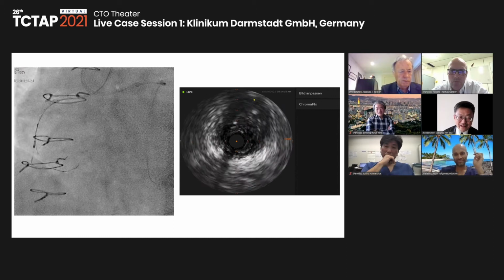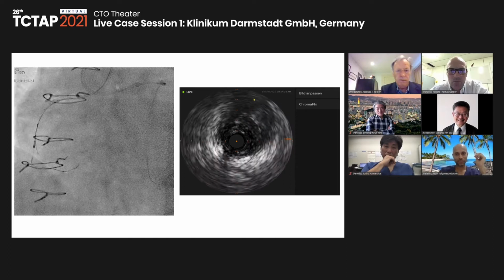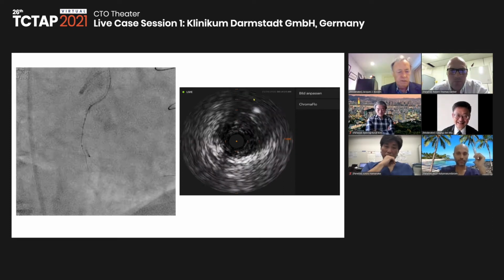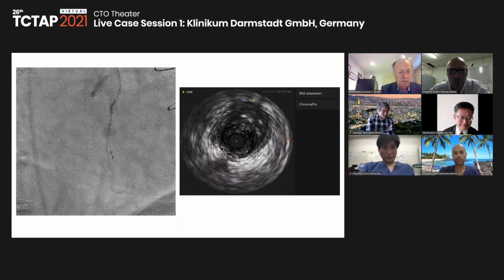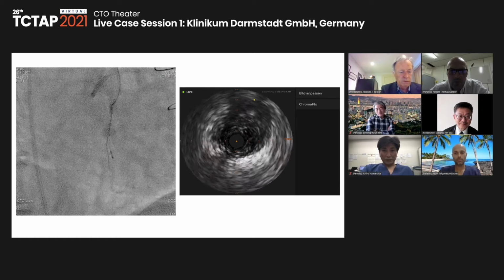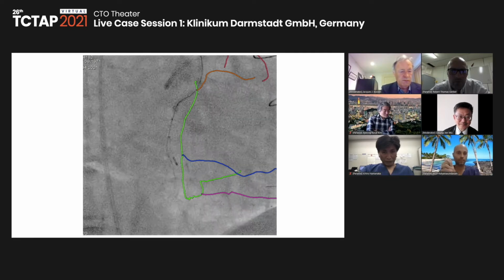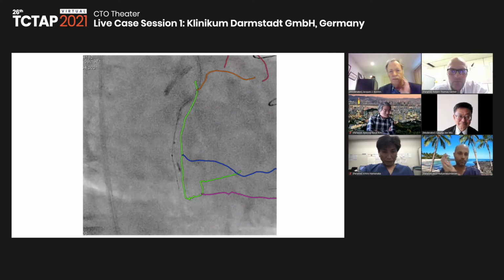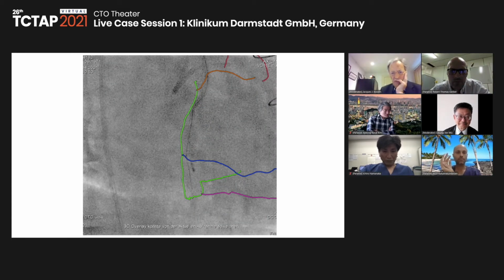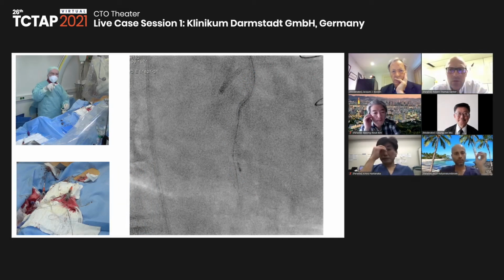You see, now let's go to the A-plane fluoro, because you see, I could probably have So you see the A plane here. Yeah, right. We are already on course in the vessel. Yeah. I can overlay now. I can do an overlay here. Yeah, that is kind of what you see on the A plane. Yeah. It's not moving with the heart, but it's kind of an orientation. And that looks good. And if you show me the CT scan, please show the CT.